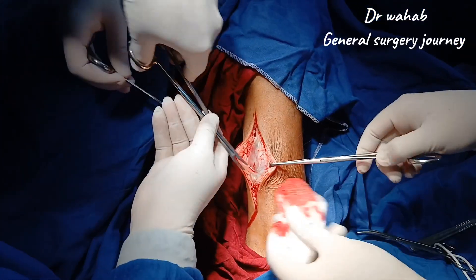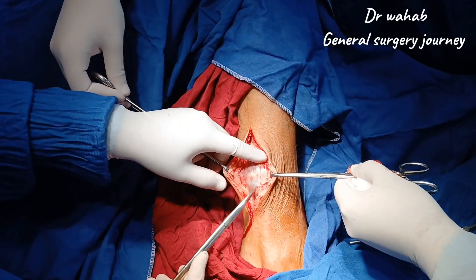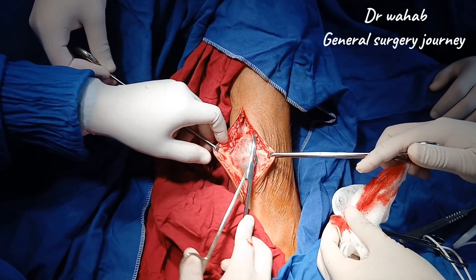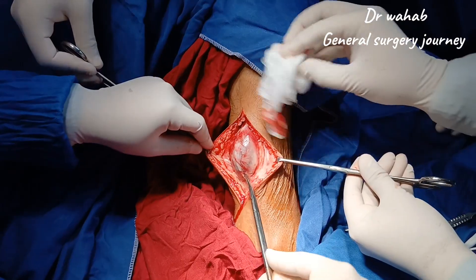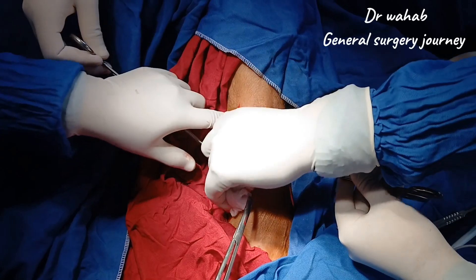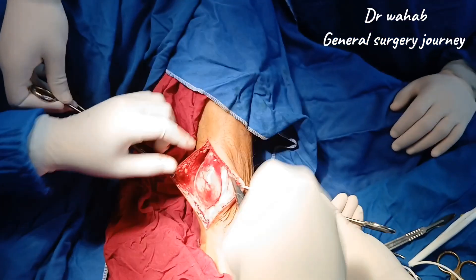As we deepen the incision, we encounter fibro-fatty tissue. Gentle blunt dissection is performed to identify the capsule of the mass, which is visible as a shiny, well-defined surface. At this stage, we confirm that the lesion is egg-shaped, firm, and well encapsulated, with no apparent infiltration into the surrounding structures.